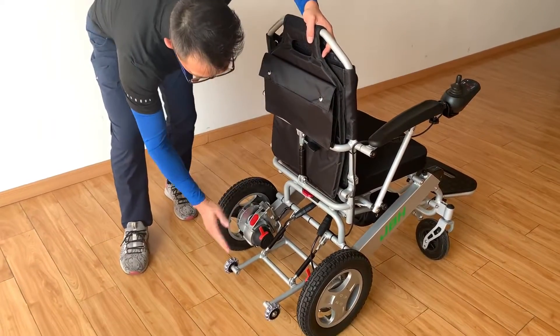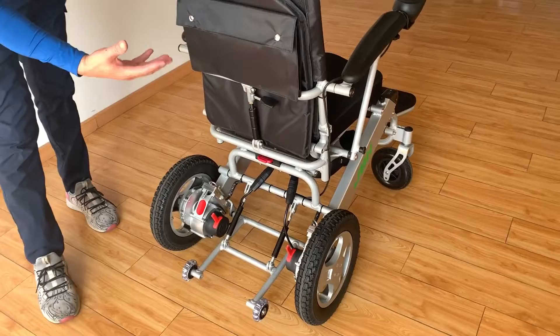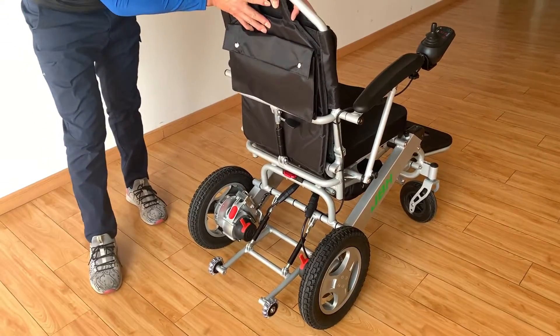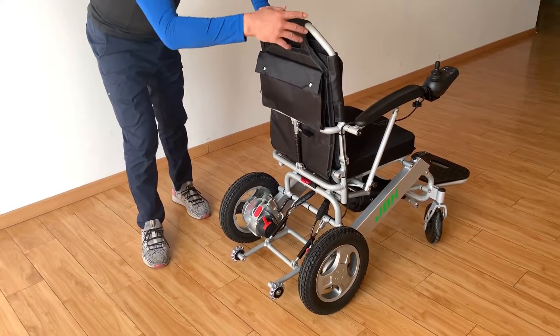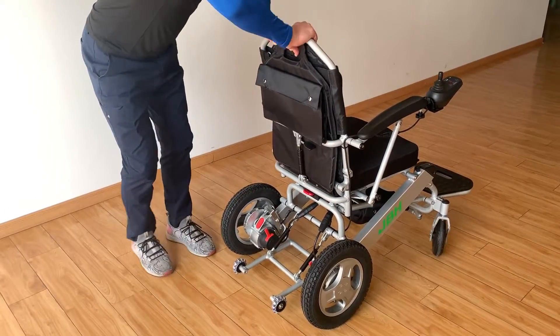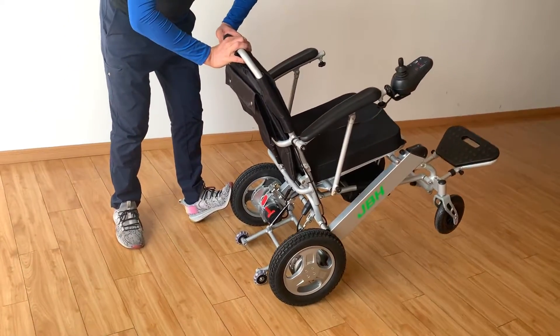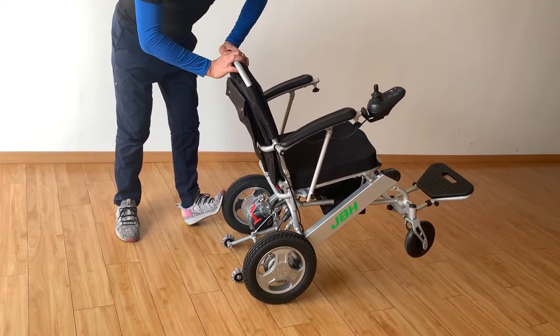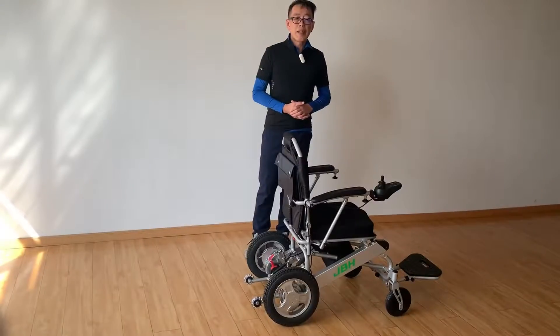If you look at the anti-tilt wheel, this is really important for protection. When you go up a hill and the wheelchair goes back, it's really dangerous. We have two dampers here that create a shock absorber function for when you come across certain urgent situations — it's really good and safe.